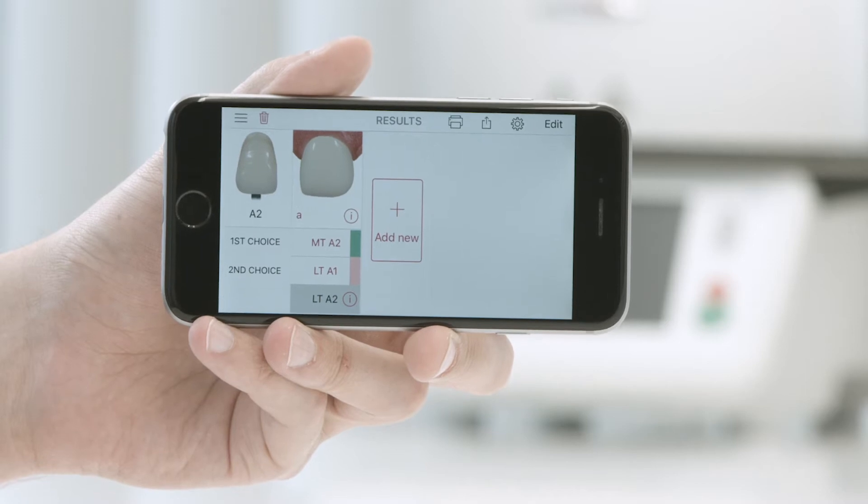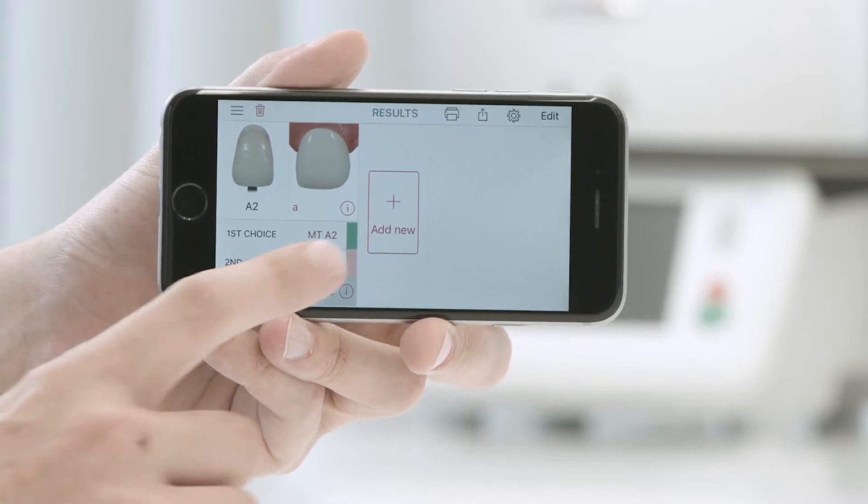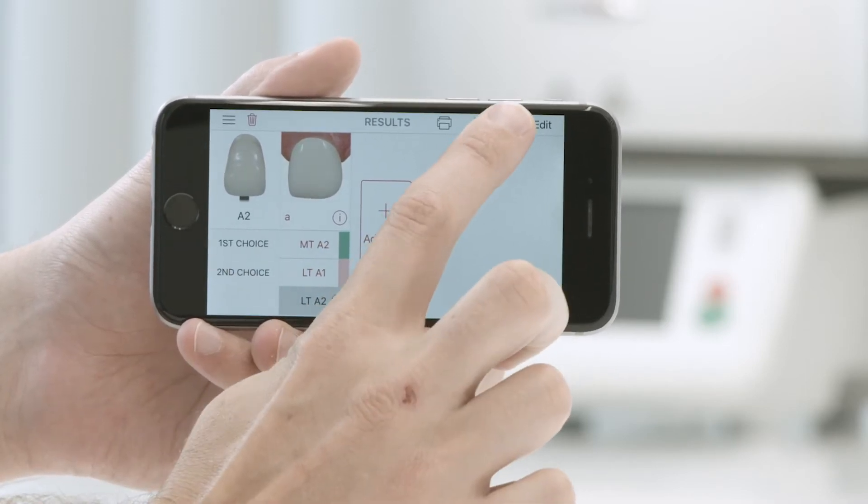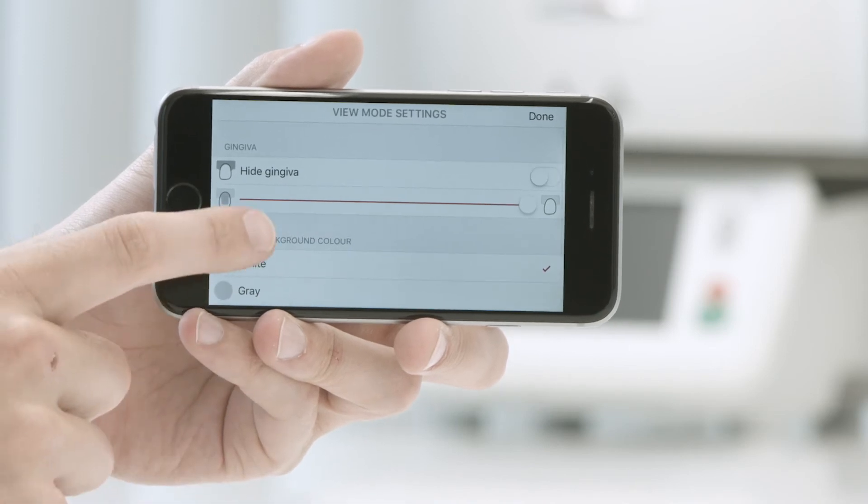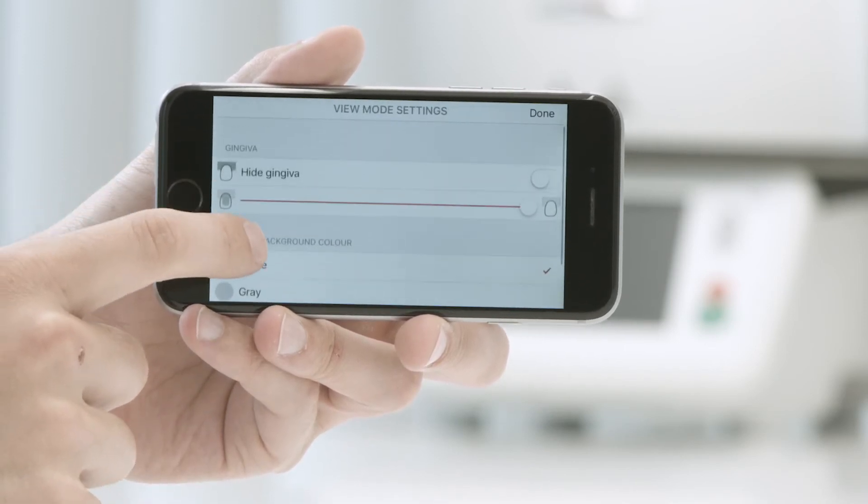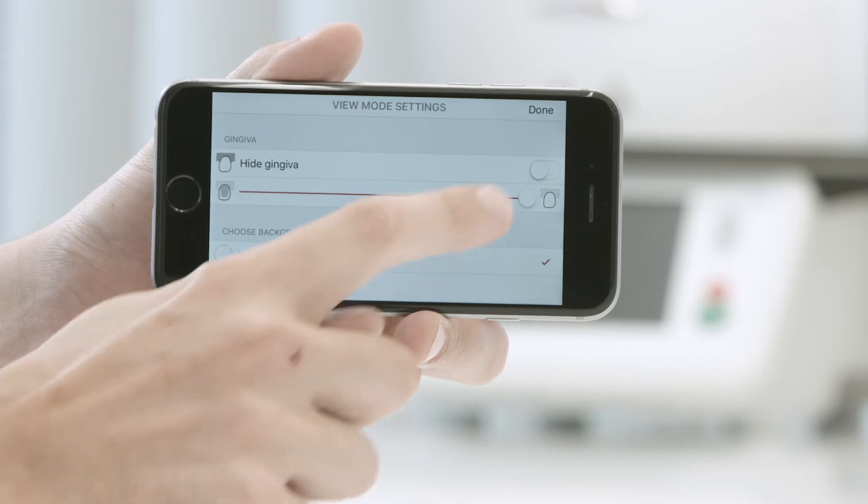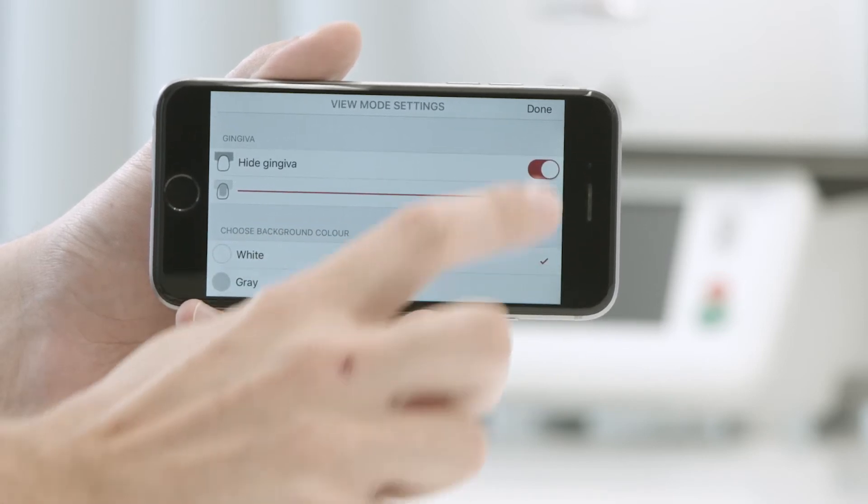Under the menu item View mode settings, you can make various display adjustments in the result window. For instance, to show and hide the gingiva, select the gingiva button next to the gingiva icon.